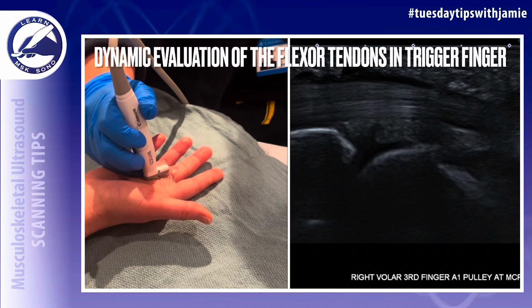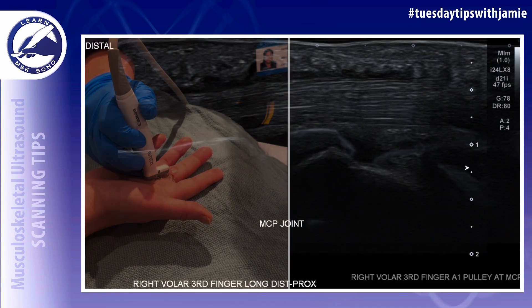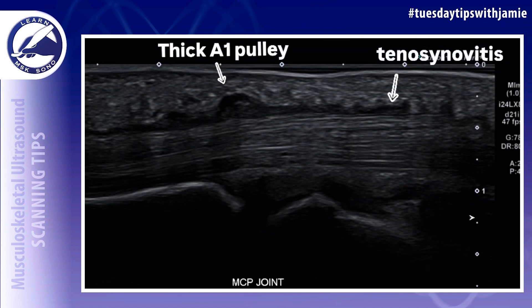When trigger finger is present, there will be thickening of the A1 pulley visualized superficial to the flexor tendons, which are the FDS and FDP tendons, at the level of the metacarpal phalangeal joint.